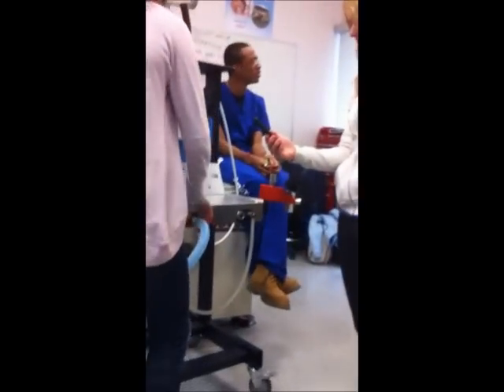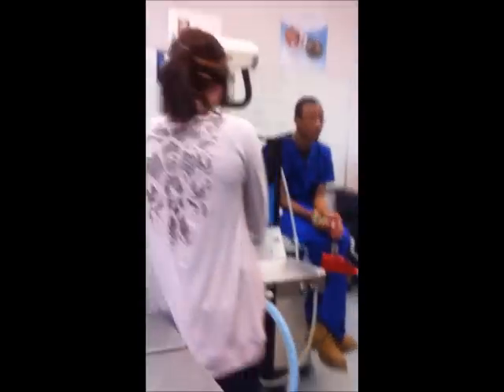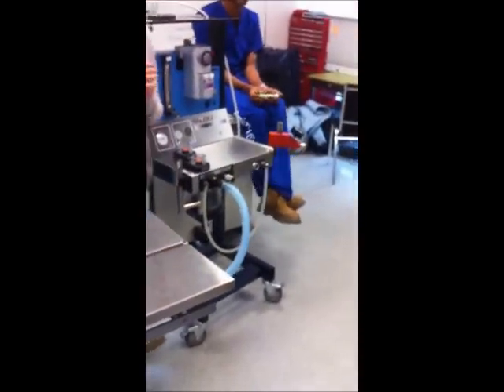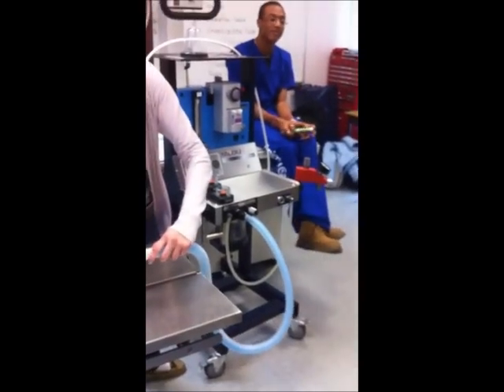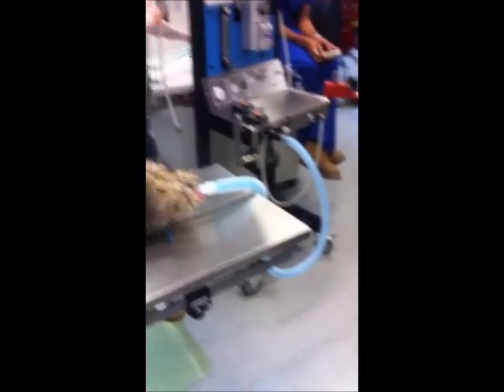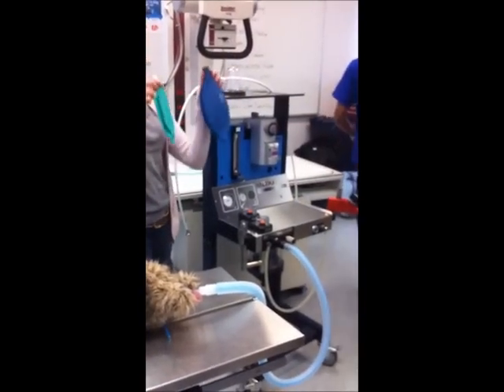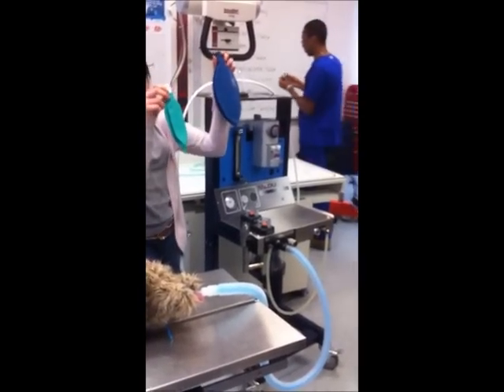Don't hook it up to the dog yet, right? No. That one goes on the dog. Okay. Hello. It's nice meeting you. And now you need a balloon. Which one? The blue one. But why? Because it's bigger and it's blue.